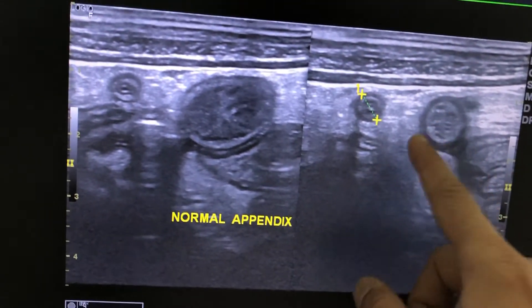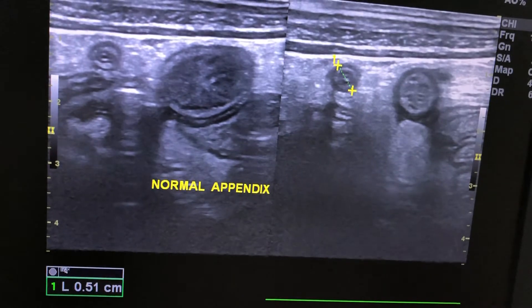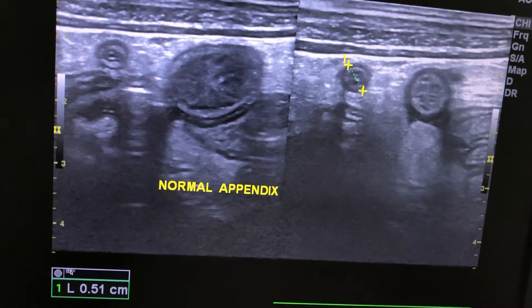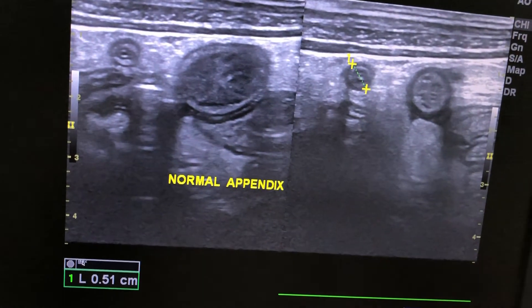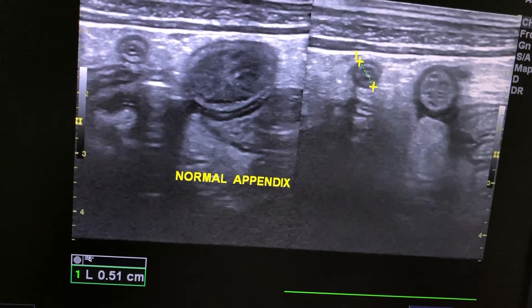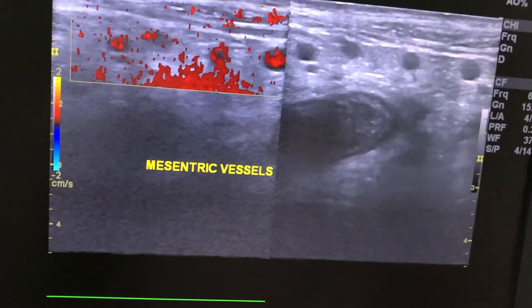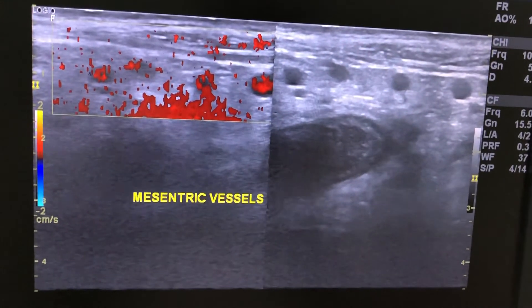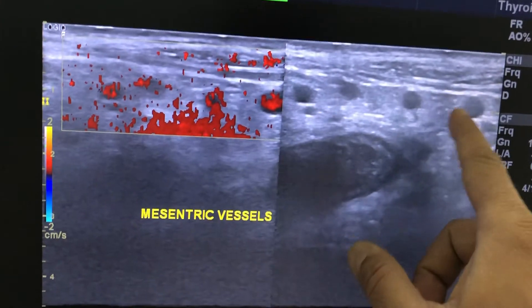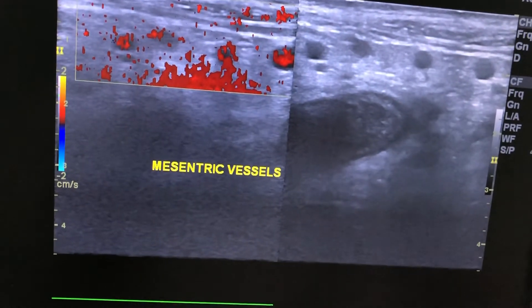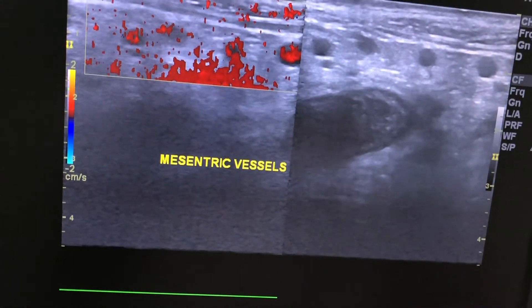This is a bowel loop, also covered with peri-enteric fat. These were some mesenteric vessels which were dilated, around 4 mm in size.